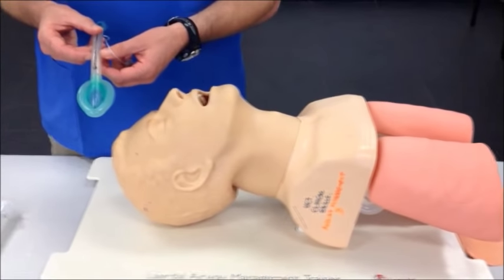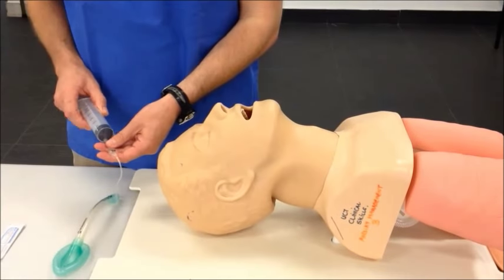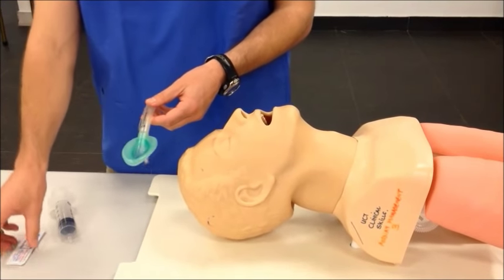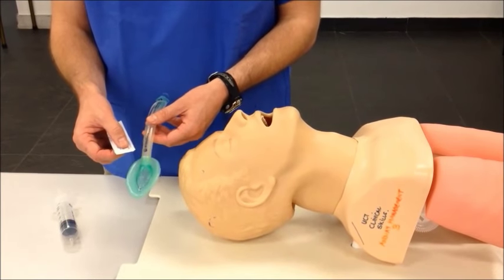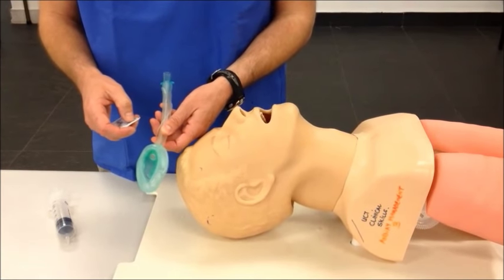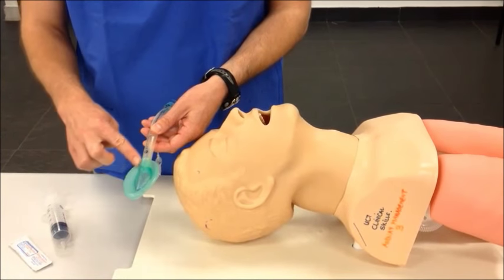Before using the LMA airway, make sure that the cuff is fully deflated and that there is no further air in it. Once the cuff is collapsed, the next step would be to use a water-based gel lubricant to lubricate the back of the LMA device. It's important not to lubricate the airway up front as gel may obstruct the airway. Once the gel has been applied to the back, consider spreading it gently and evenly around.